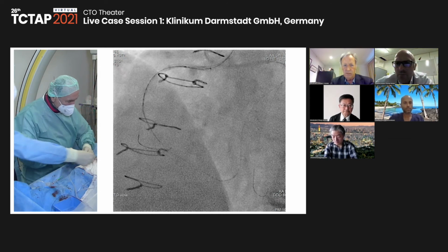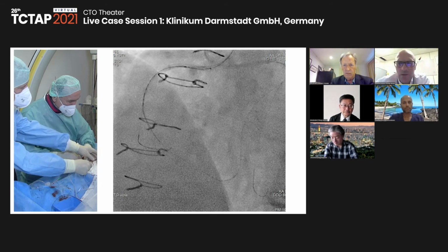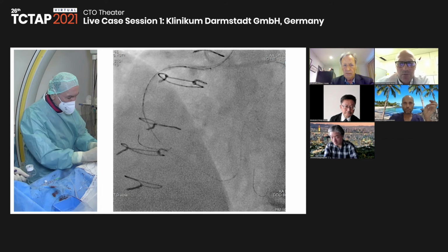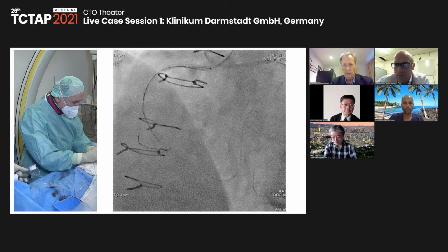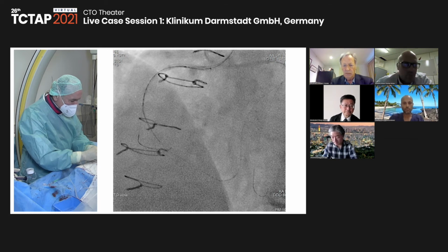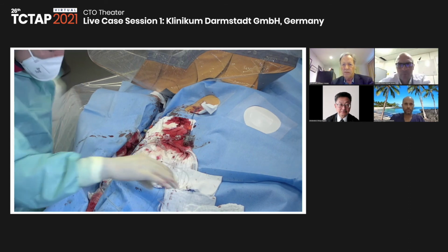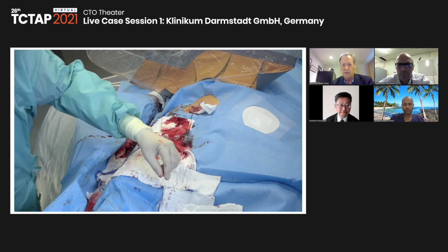So the Lima is on the PL, is that right? Yes, the Lima is on the PL of the circ. It's a tiny branch. Okay, sorry. Yeah, it's a very tiny branch. So we will do dilatation with the 2.0. No, first I have to remove the Caravelle.